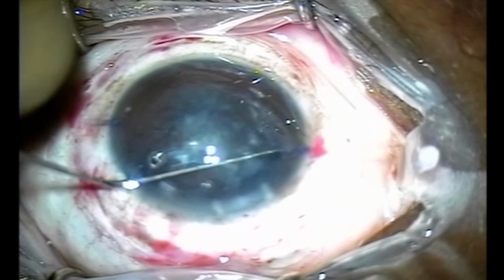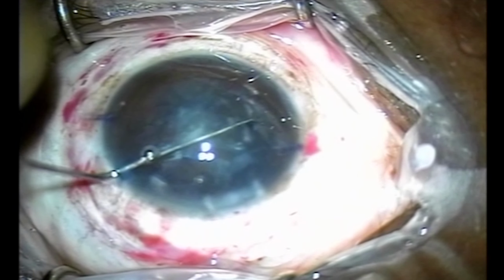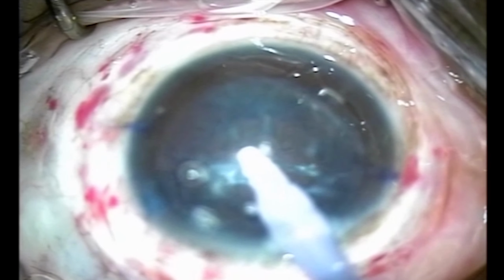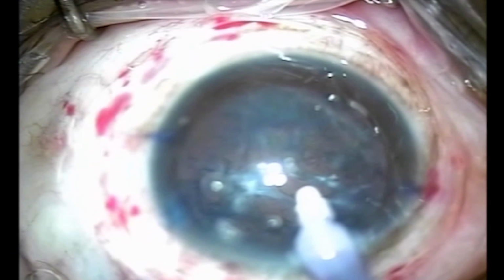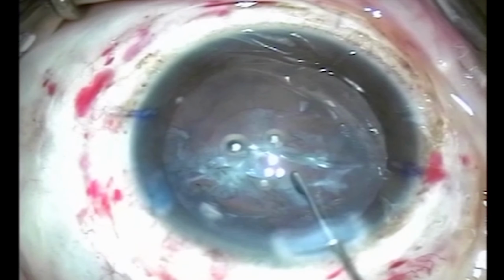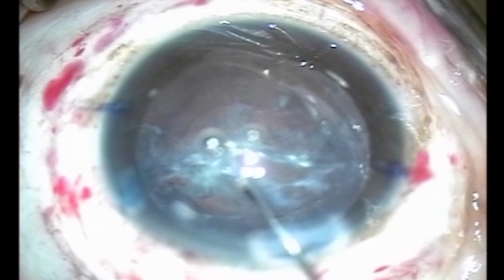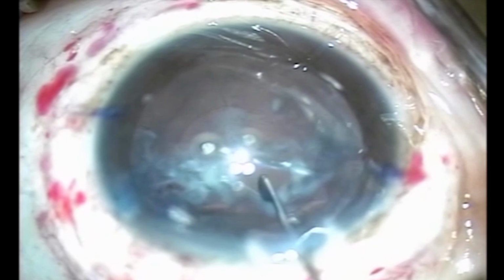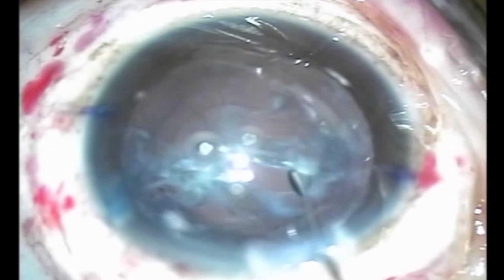I now use a Drysdale to separate the leaflets and loosen some cortical material if I can. Now going in with the irrigation aspiration, I try and get some loose cortex, and I'm not so bothered about the fibrotic periphery. Now I examine the posterior capsule and I see over here extensive fibrosis and also a definite area of opening. So I must make a posterior capsular access, and I think how.